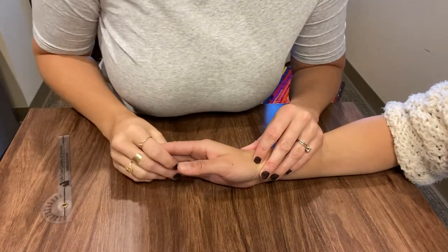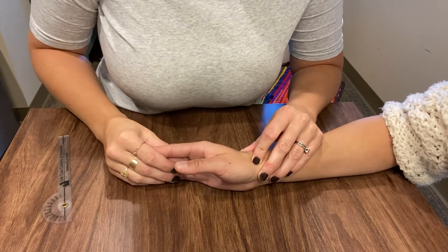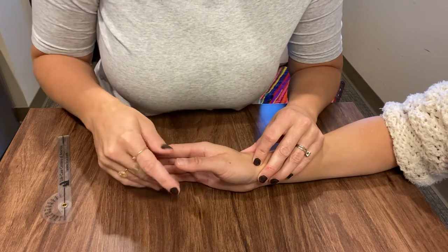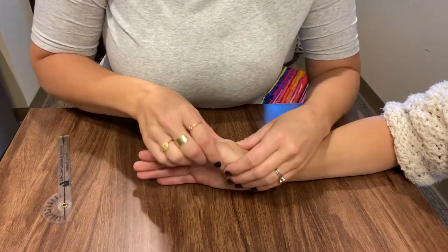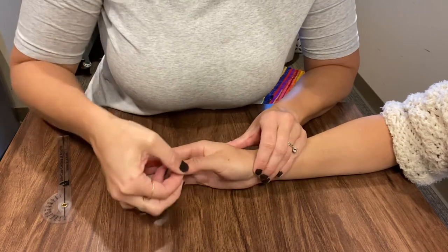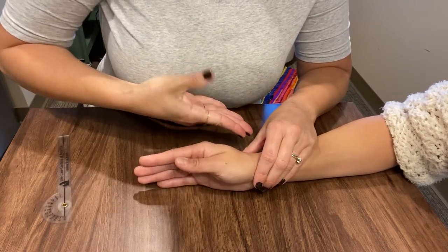This is thumb CMC joint palmar abduction. Your landmarks are the same — you're just measuring a different movement. So instead of moving away from the radius like we did before, we're moving away from the palm. You're making like an L with your thumb.